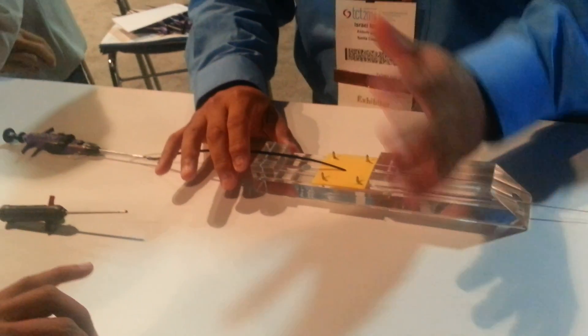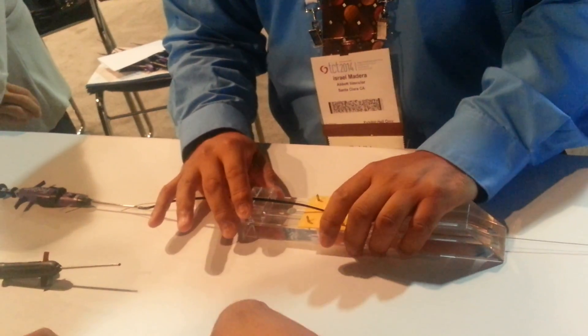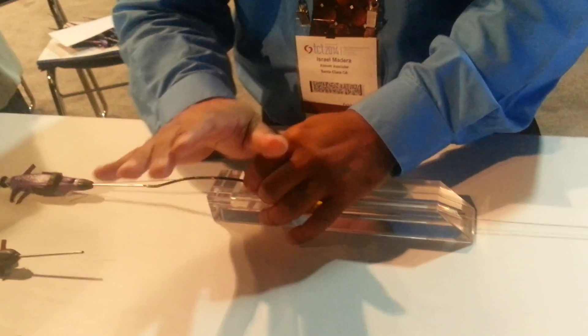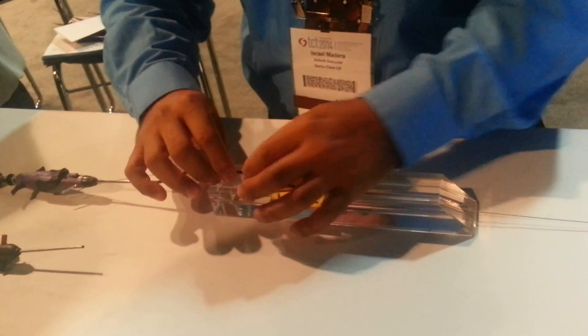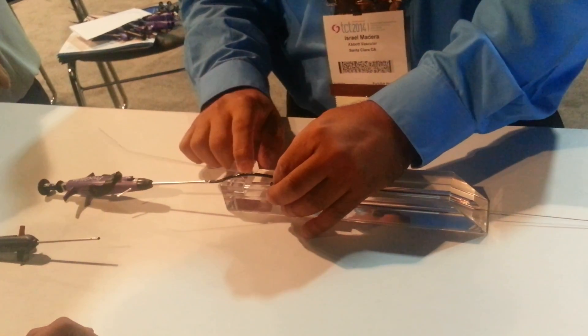So before you go any further — hold on. All we're going to do is we're going to advance. We're going to go ahead and take this. We're going to assume this is the skin level. This is the skin level.